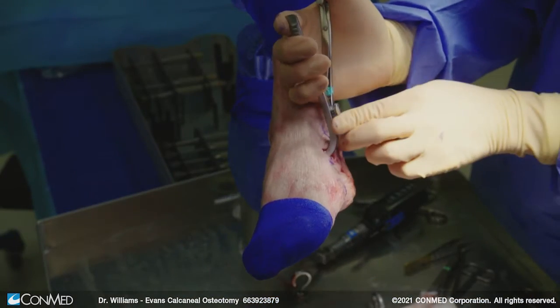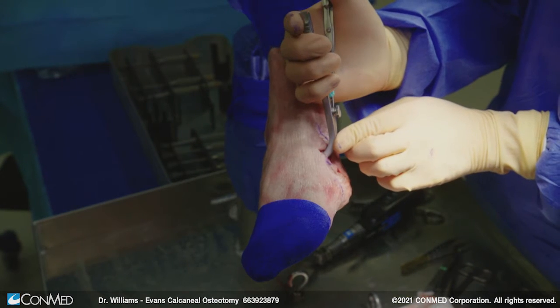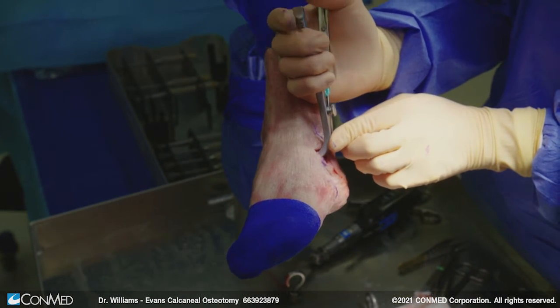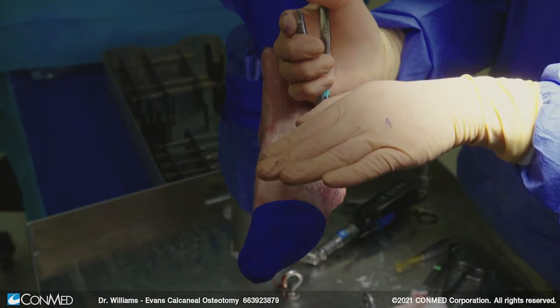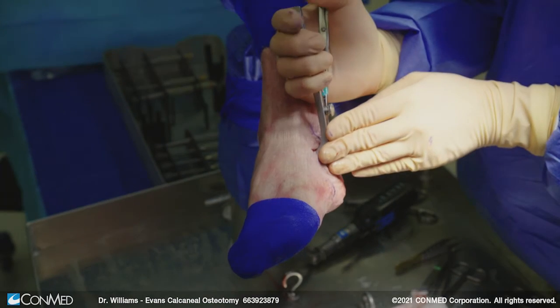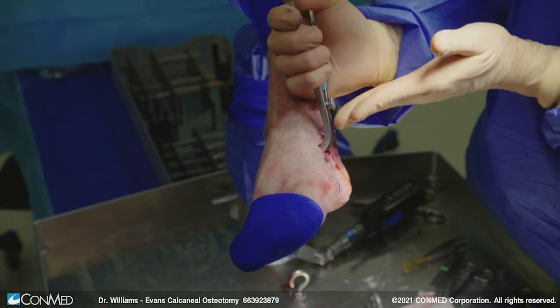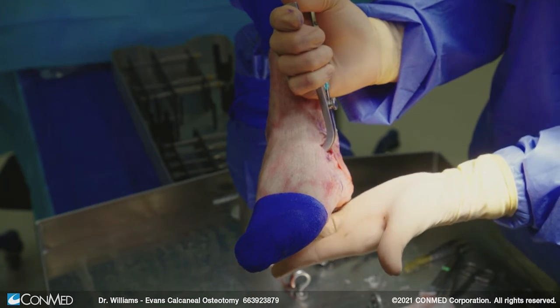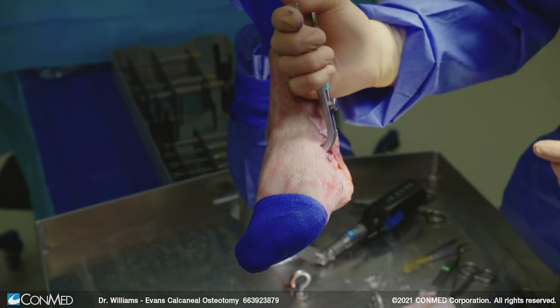To show you this triplanar correction, we'll simply take an aim retractor, stick it into the osteotomy and open it up. As we open it up, you can see how that pushes the forefoot over medially and how it will take the forefoot varus out. Obviously the more pronounced that deformity is in your patient, the more you'll see this. Some of the power of this as well is that as you lengthen that lateral column, the peroneus longus is going to be tensioned, and that's what helps to pull that medial column down and takes out that forefoot varus.